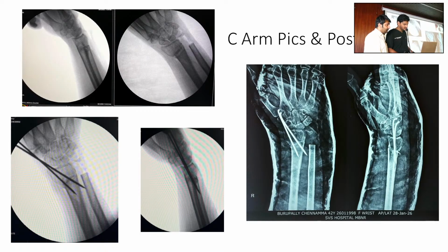This is okay, but this much is enough. The plaster was applied the wrong way. The plaster should have been made towards the ulna. This gap is there. Ulnar deviation should have been given when applying the plaster. Palmar flexion doesn't matter.